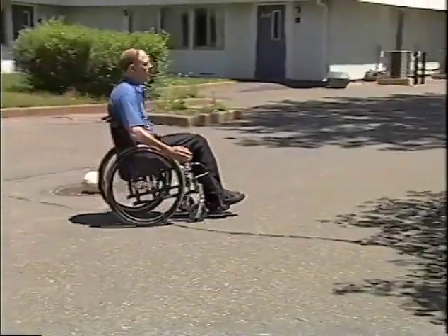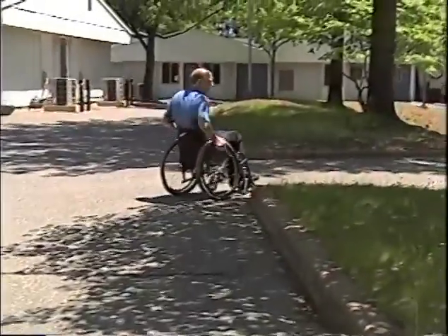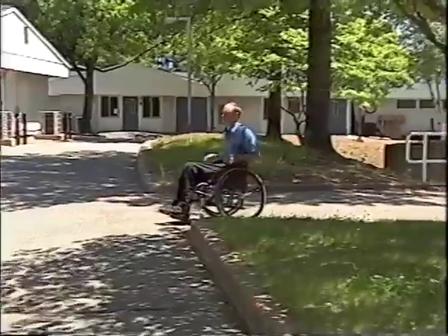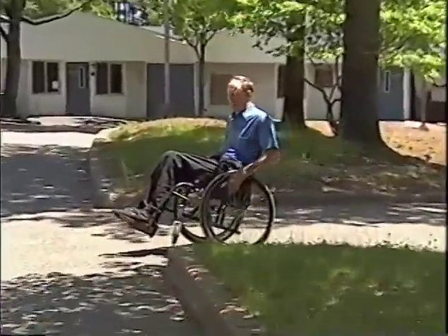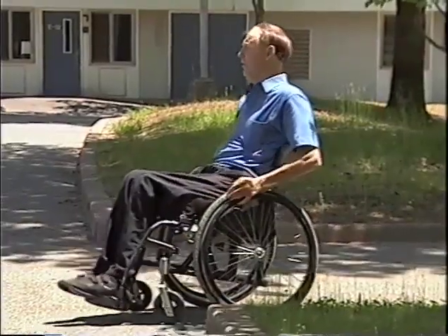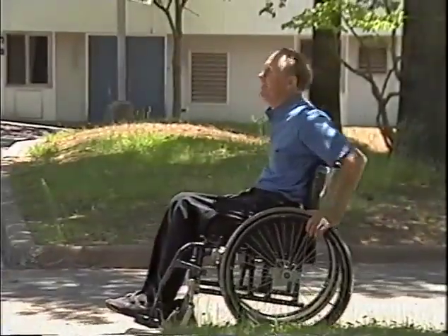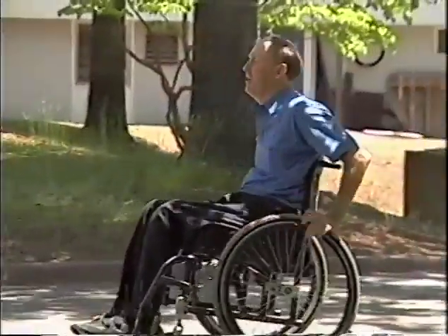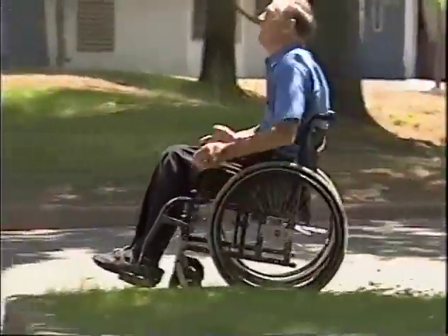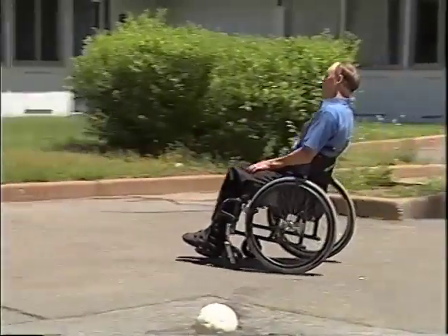So if you don't want to follow the curve, put the weight on the back end. The basic thing to remember, if you want the chair to go straight, put the weight on the back end. The back wheels are parallel and fixed. They won't follow the road as much as the front wheels do. So if I came out of here and say I wanted to wheel over to the other building across the way, I would try to have a little bit of speed up and lean backwards. Now the hole is not affecting me as much.